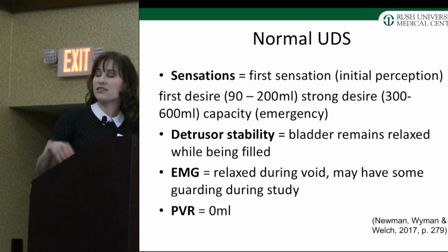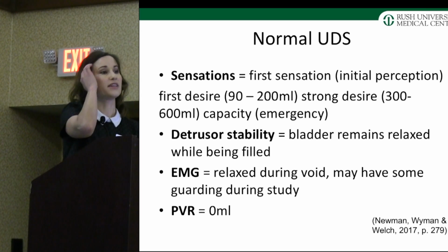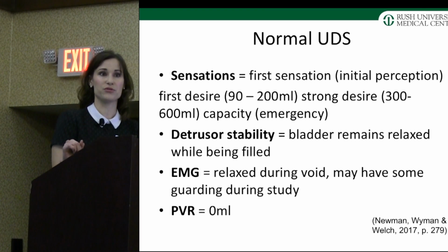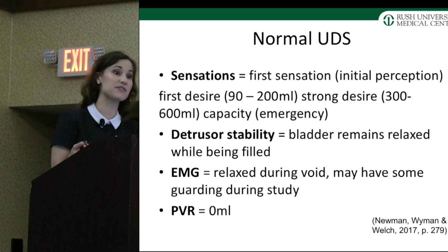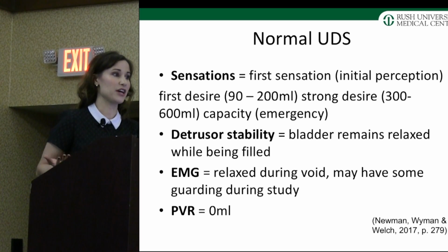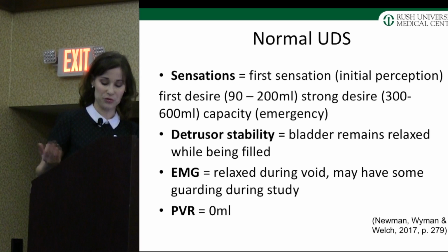EMG, that's the little stickers that you can put on the patient around the rectum. Those look at the electrical activity of the sphincter and the pelvic floor. And then ideally your PVR, the patient should be emptying completely, so a PVR of 0.